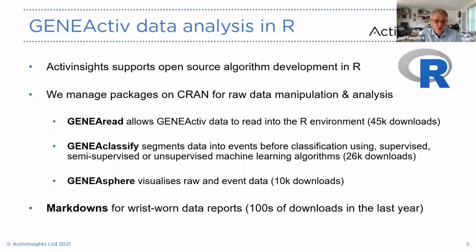And so those markdowns we relaunched about a year ago, and there are a couple of hundred downloads of that over the last 12 months. So not as widely used, but actually increasing very quickly as more sections of that become validated.